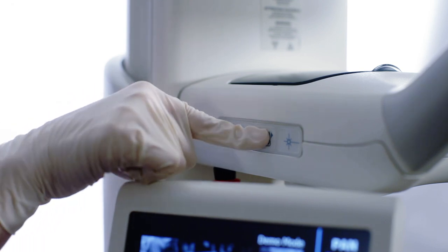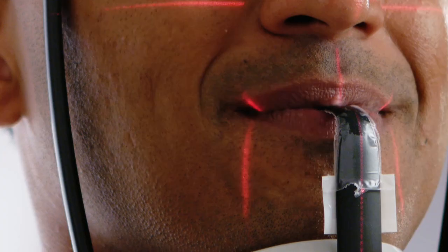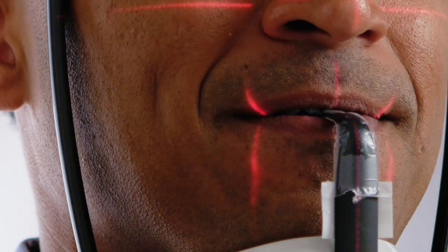Close the head support wands. Inform the patient to remain still. Ask the patient to smile and align the cuspid laser with the leading edge of the cuspid. Instruct the patient to close the lips around the bite piece.